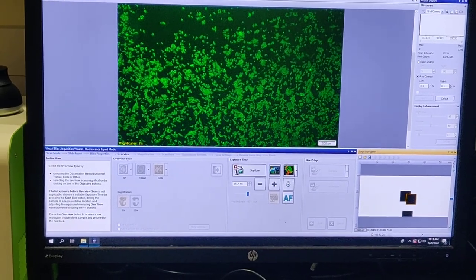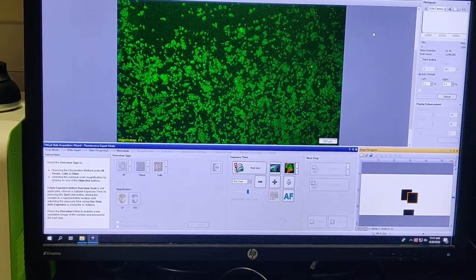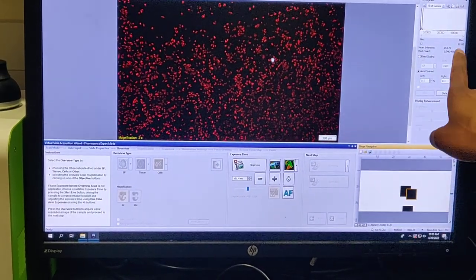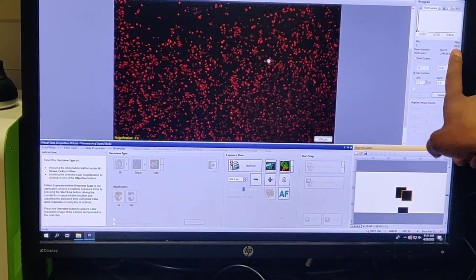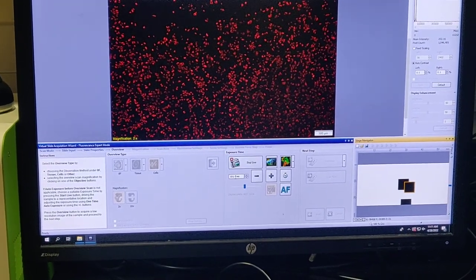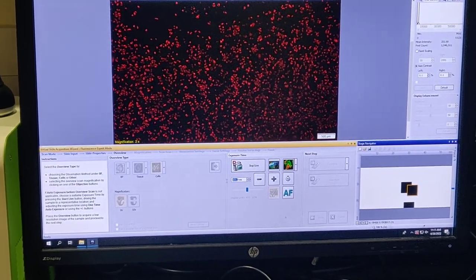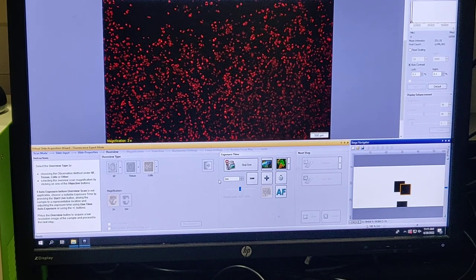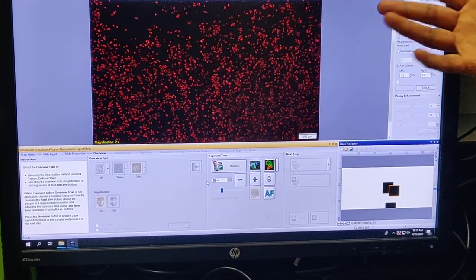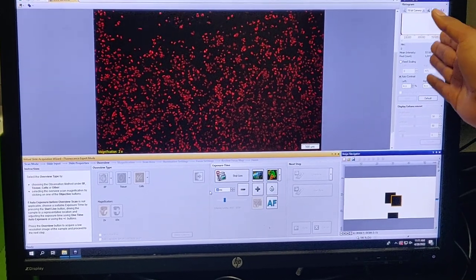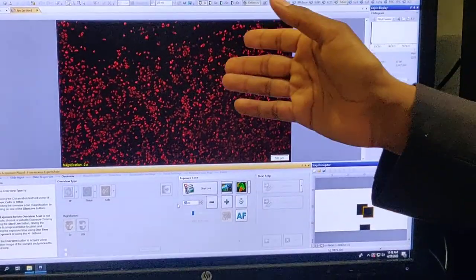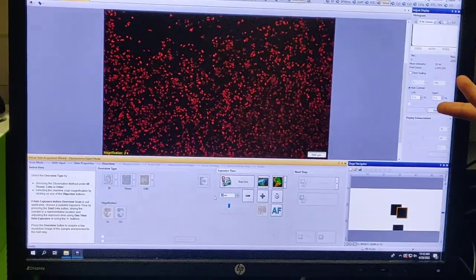I'll now try Texas Red. Cells look very nice and beautiful, and intensity is 11,000 units — pretty good. In fact I don't even need 100 milliseconds; I can do 50 or even 20 milliseconds. At 20 milliseconds I'm getting 2000 units, which is a good signal. Anything above 1000 units is a good signal; anything below is questionable. So I'll use 20 milliseconds with Texas Red.